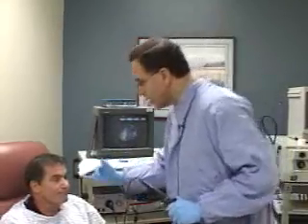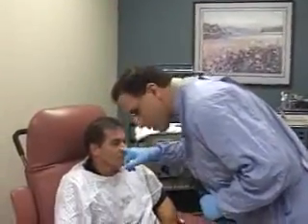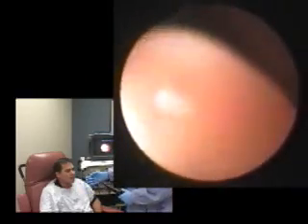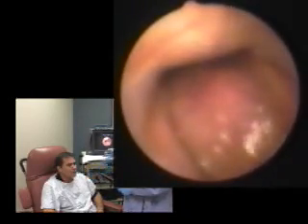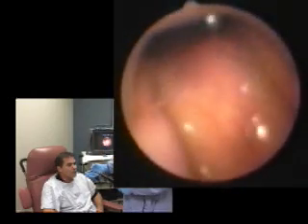So again, I will hear the patency of the, they both sound equal to me. We will try to stay at the floor of the nasal cavity. We are passing between the inferior turbinate. We just cleared the nasal cavity, looking at the nasopharynx. Are you okay, Chuck? Yes.